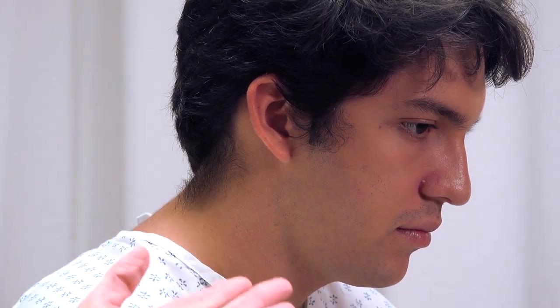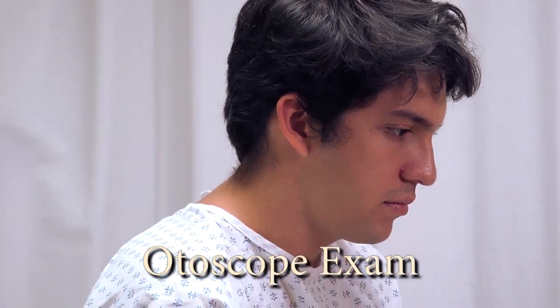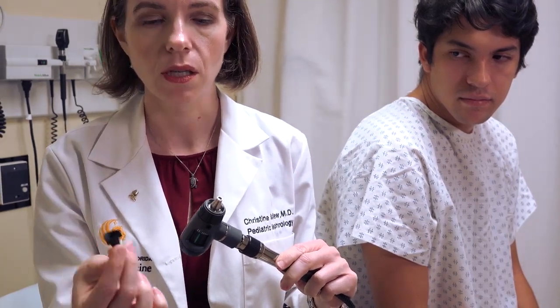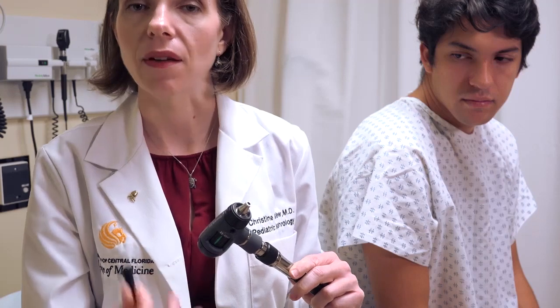To examine the ear canal and the tympanic membrane, we need to use the otoscope. This otoscope here in the Clinical Skills Center has a portion on the front where the light is, which allows us to attach the speculum. This keeps it clean and allows easy insertion into the patient's ear. Make sure you use a new speculum each time you examine a patient. You can use the same speculum from one ear to the other if there's no drainage or significant ear wax, but if there is, you'll need to change speculums between ears.